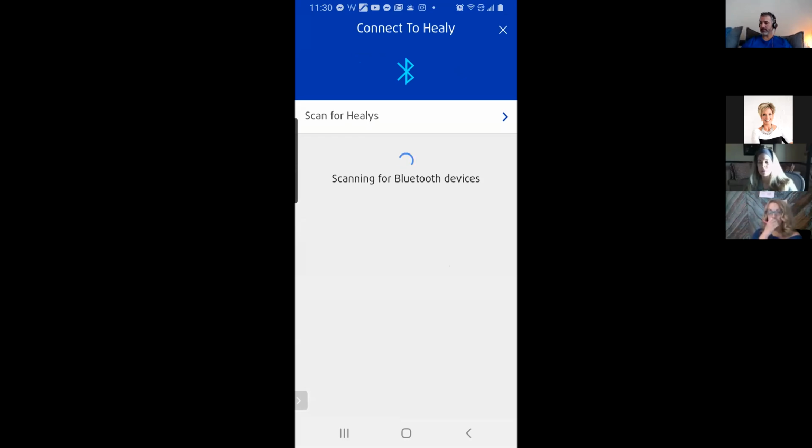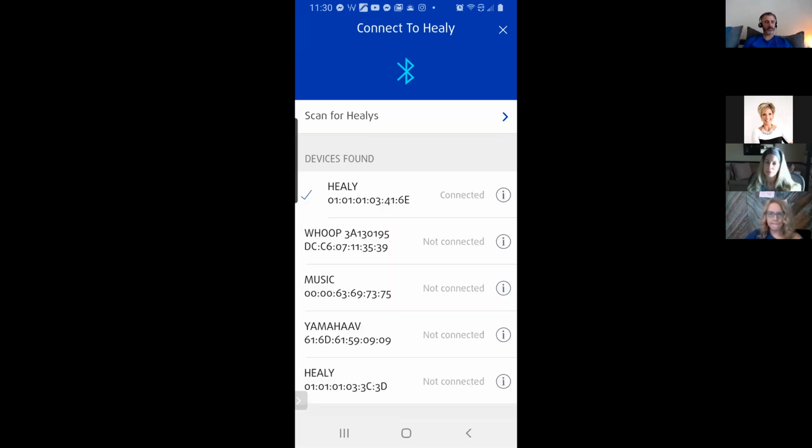So we're going to make sure this is on. It is on. All right. Now, one thing you notice, this says ending in 6E. I have multiple devices in my house, so on the back of it, on a sticky note, I put the last two of the serial number. That way, when I pick up a device, I know whose it is.